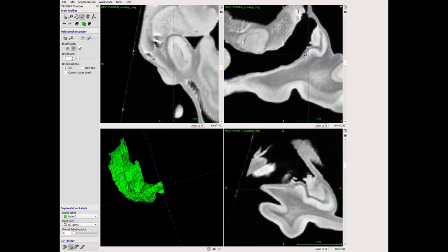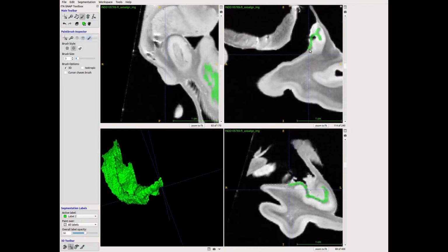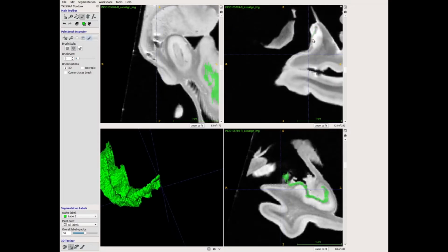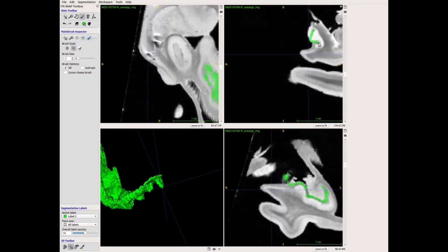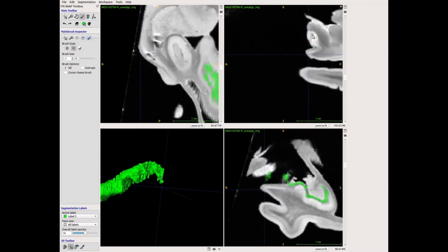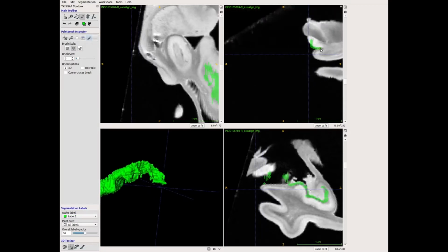So you can see at the top right, there's my mouse. I'm tracing this dark structure. I'm making the label appear and disappear. This is one of the features of the program I'm using. The program is ITK-SNAP. I'll post a link to that as well. And it just has a lot of great little segmentation tools, and it's pretty lightweight. It's a nice tool to use. And so, yeah, I'm just drawing this dark structure.